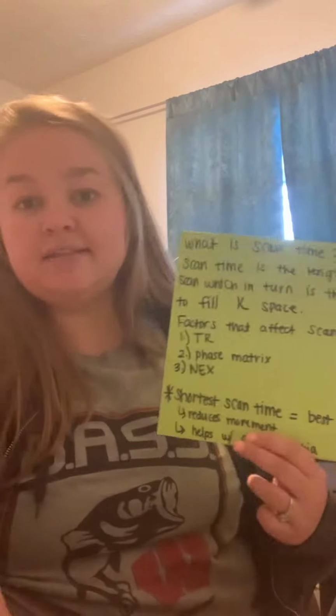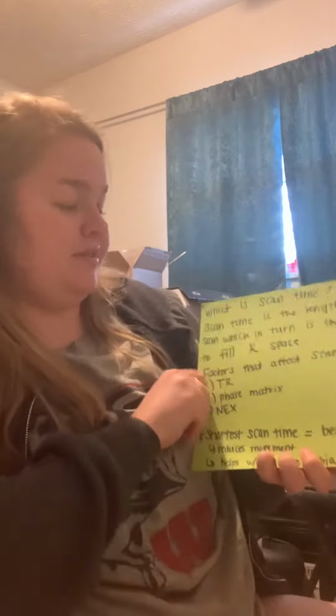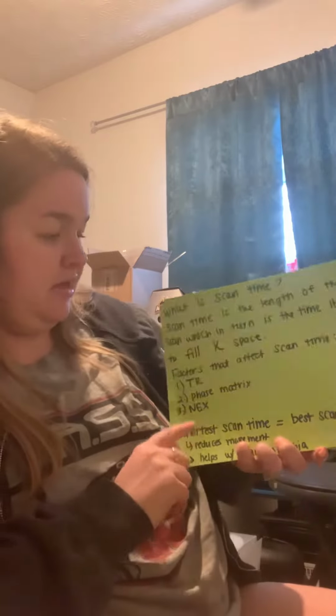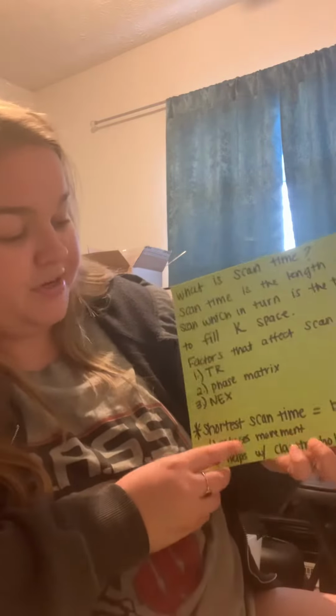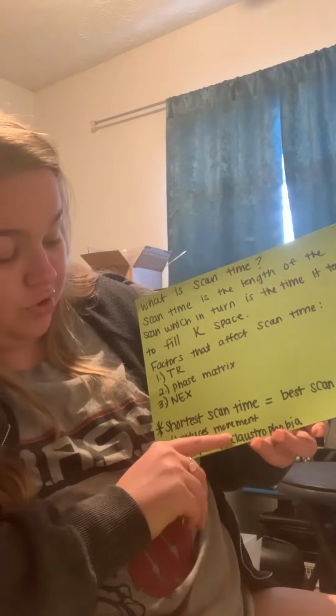So what is scan time when talking about MRI? Scan time is the length of scan, which in turn is the time it takes to fill up the k-space. Factors that affect your scan time are your TR, your phase matrix, and your NEX. The shortest scan time equals the best scan time. It reduces movement and it helps with claustrophobic patients.